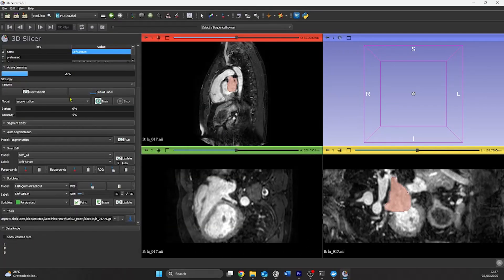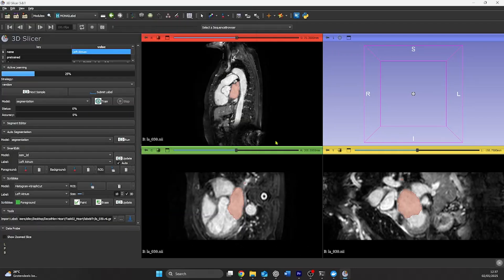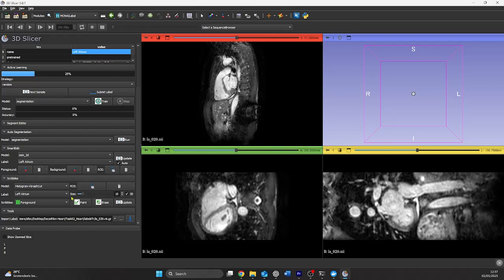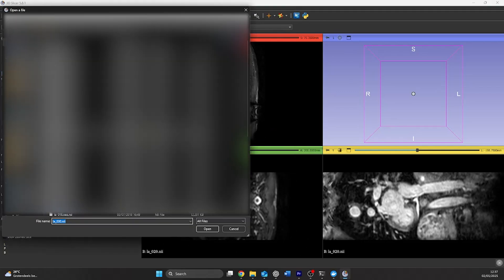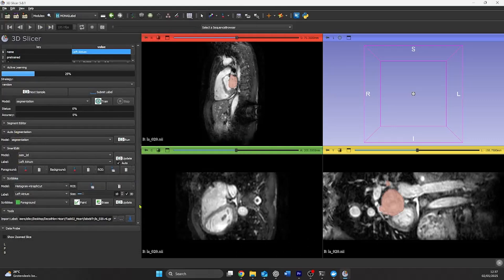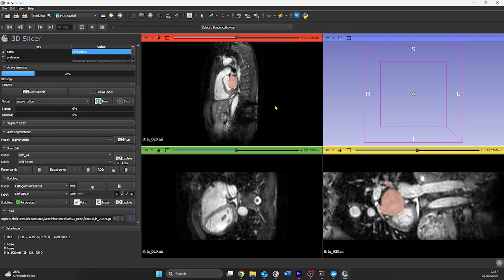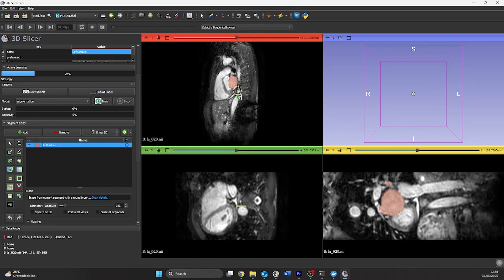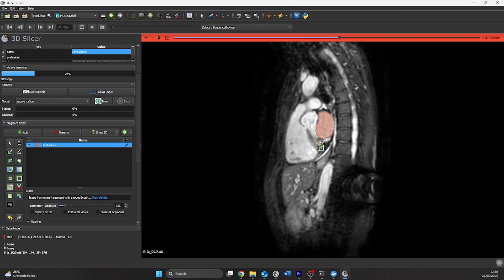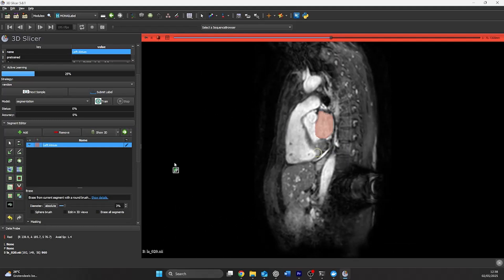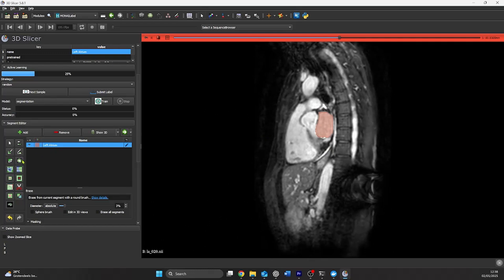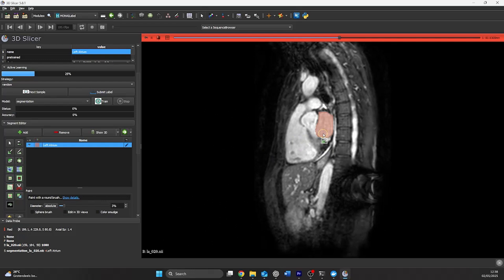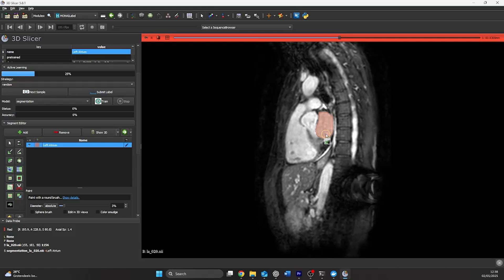We then do this a couple more times to give our model more data to work with. Next, I'll show you how you can alter your label or completely make your own label. In this case, we just altered the label a little bit. If you want to know how to make your own label or further work with the segmenter, there are lots of online tutorials available for slicer where they teach you how to segment. In this example, I will only erase a little bit of the label to then repair it back. We again submit the label to the server.